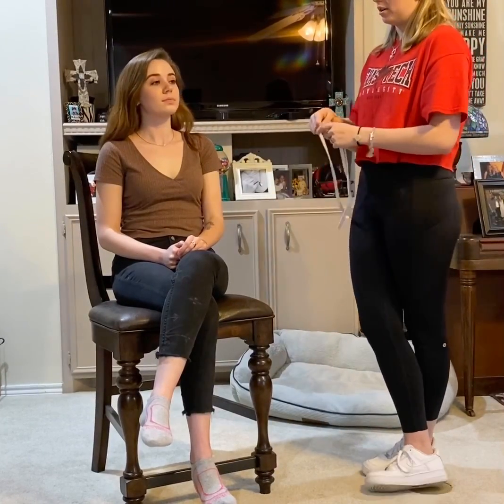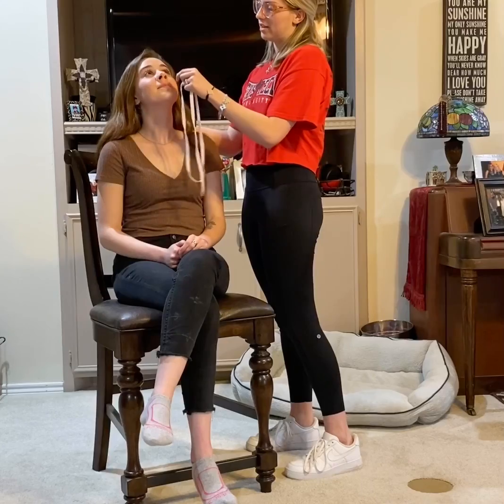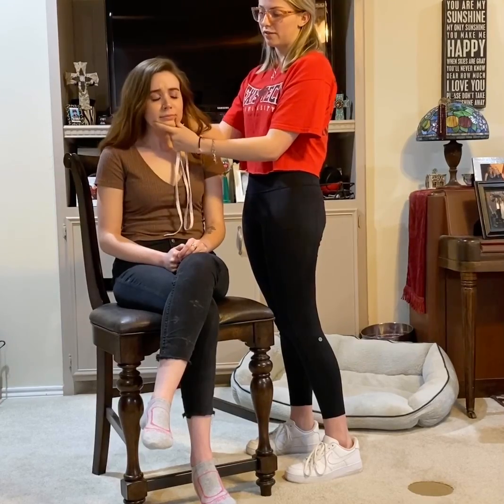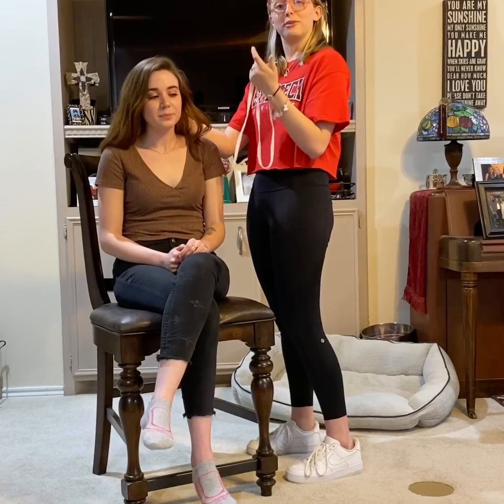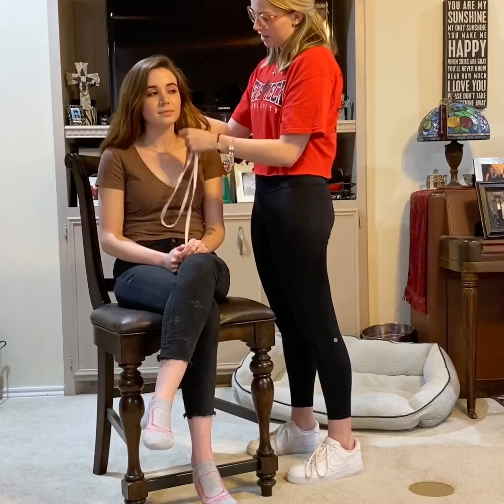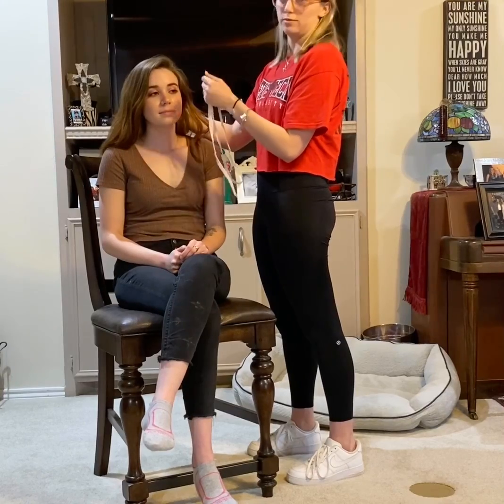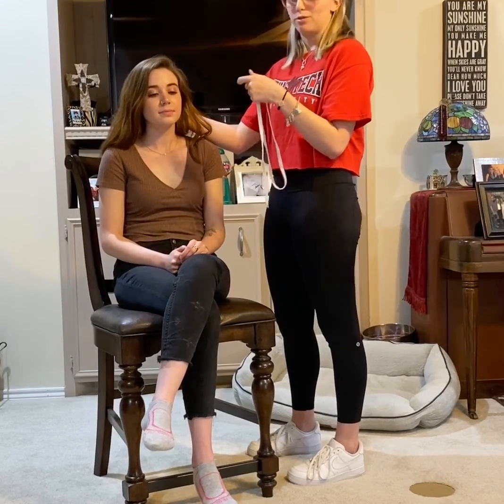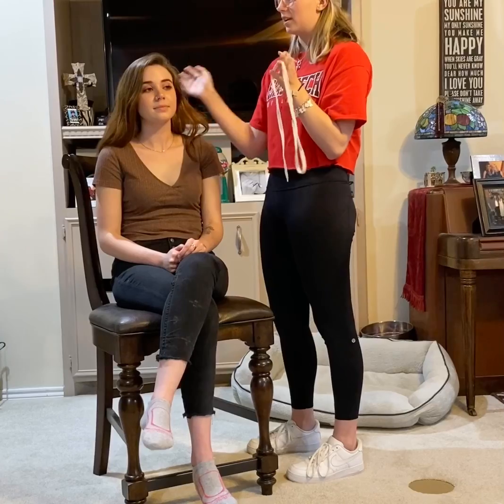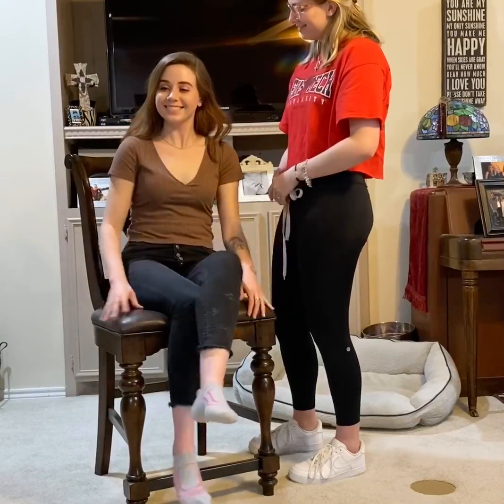After that, lube up the end and have the patient lean their head back, then place it in the nose. Once it gets down to the throat area, they'll cough — push their head forward. Don't use a lot of pressure, but they will want to jerk back, so push it down and tell them to swallow. Advance it until you reach the mark, secure it, aspirate, and check for a pH preferably less than 5, which indicates correct placement. Then get an x-ray to really confirm it, as that's the best method.